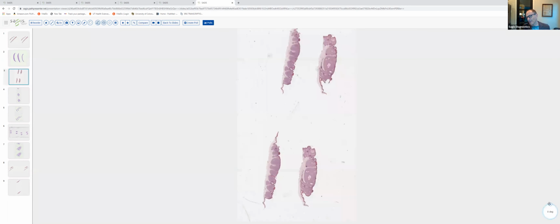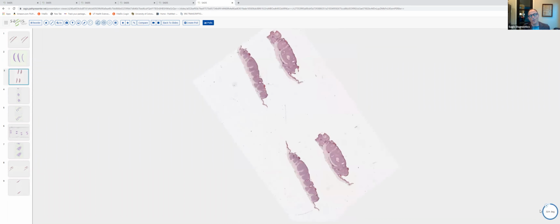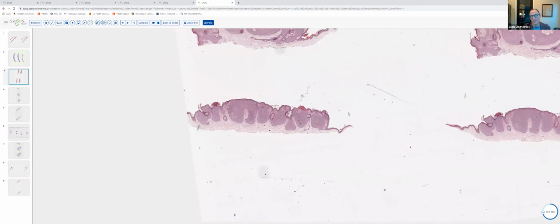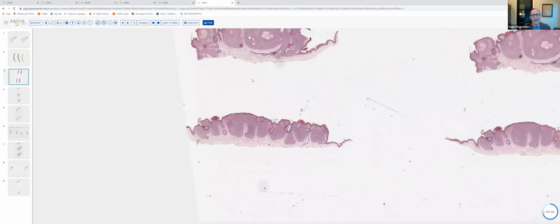Moving on to slide 3. Here the epidermis was a little bit more acanthotic, and yet we do have a very benign silhouette. This lesion appears to be symmetric and sharply circumscribed. You can see the edges of the lesion. Again, kind of a flat bottom, and we've got a very acanthotic epidermis.